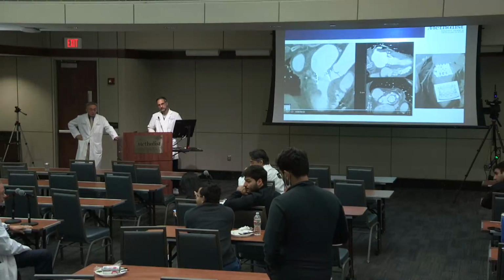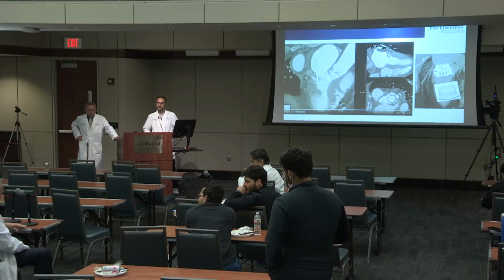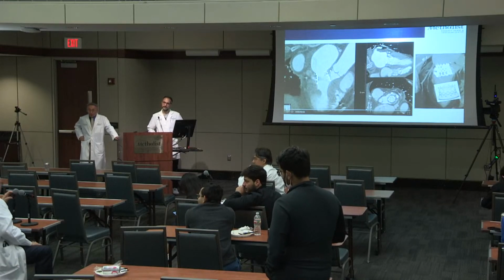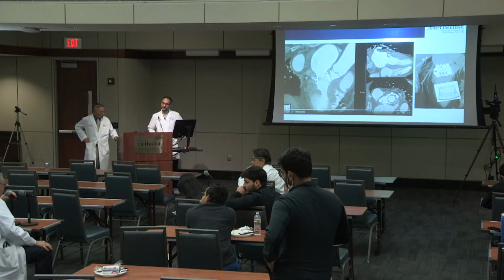Dr. Kennard, can you speak a little bit about the protocol and the risk of the exercise testing, the risk of flash edema? For mitral stenosis, I have never seen any flash edema. Again, if somebody is so sick that they're in the hospital, you're not doing anything, right? You get your information and you go to whatever you want to do. So these are mostly outpatients.